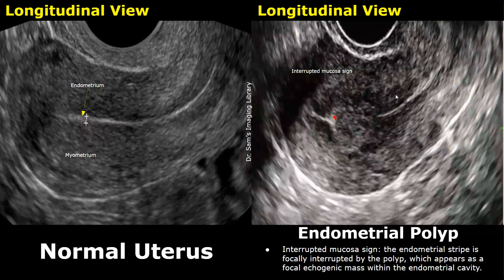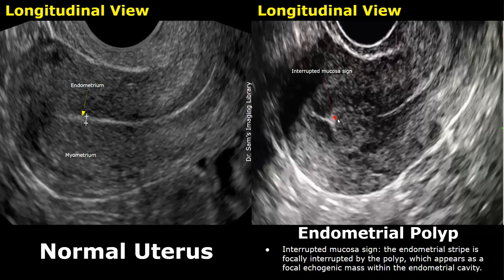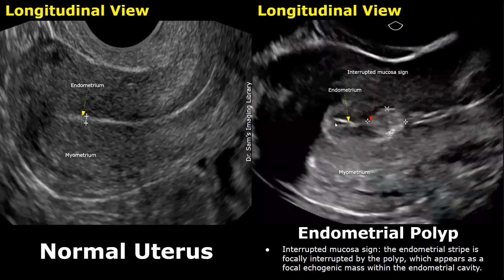The interrupted mucosa sign is another feature of an endometrial polyp. There will be a focal disruption or interruption in the endometrial stripe — the normal endometrial stripe is a thin hyperechoic line. You can see a discontinuity in the stripe, a focal interruption due to the presence of the endometrial polyp, which has disrupted the normal shape of the endometrial stripe.